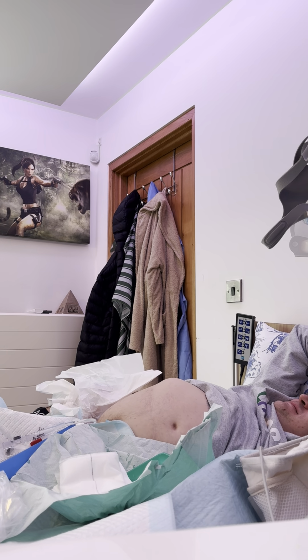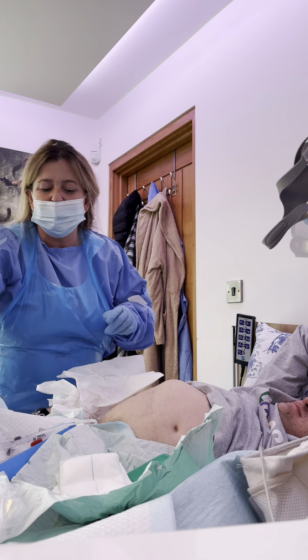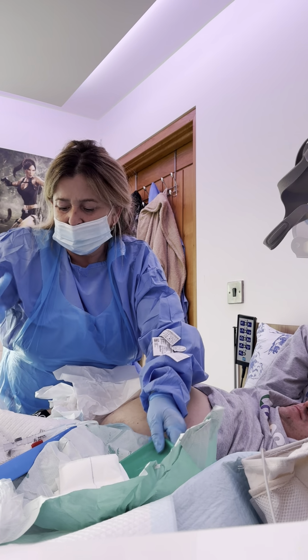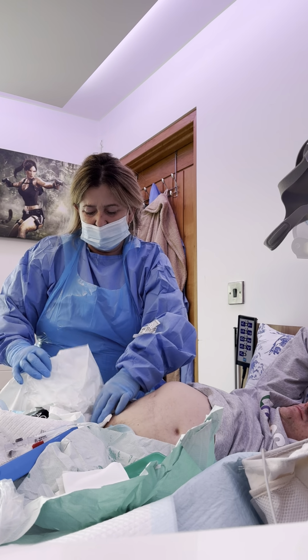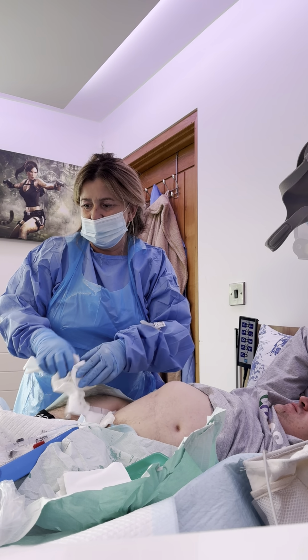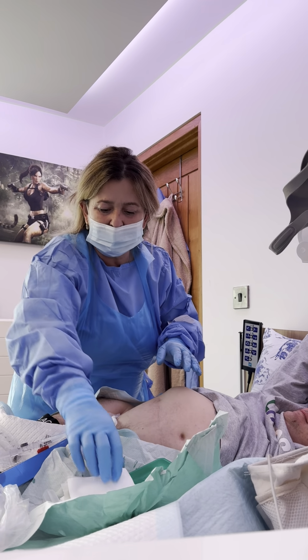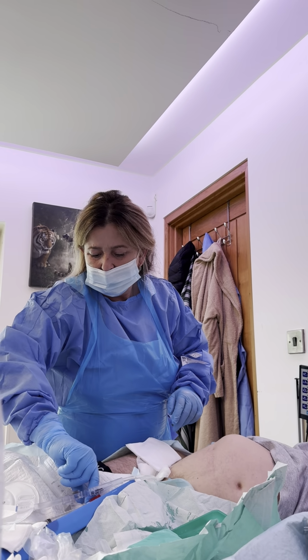Ben has not seen the brown ones because I've normally taken them away and had a look in the bin for them myself. So all you'll do is use that same catheter pack. I'll put this here for now and then I can remove this. I've just put a little covering there for you, that's all. He doesn't like anything to be there. I've covered all his skin up so no one can moan at me.